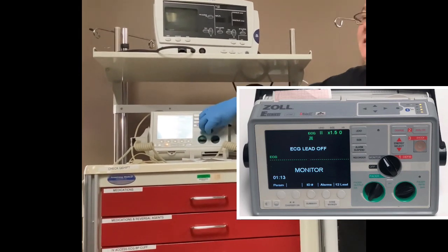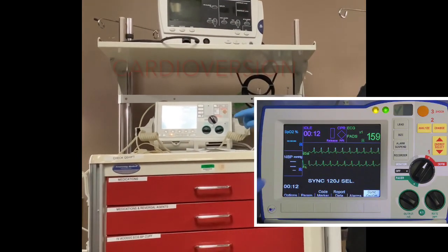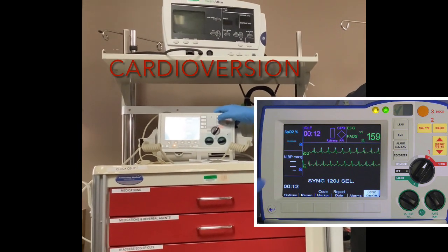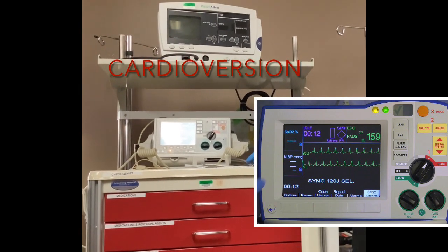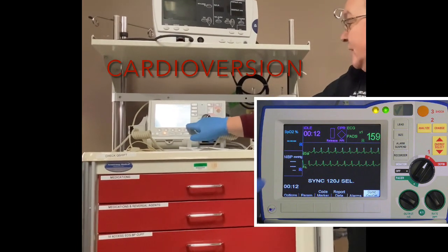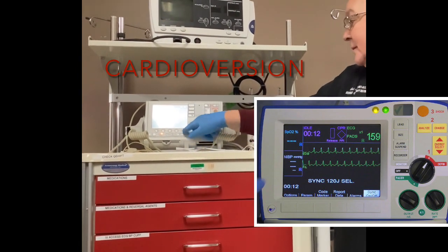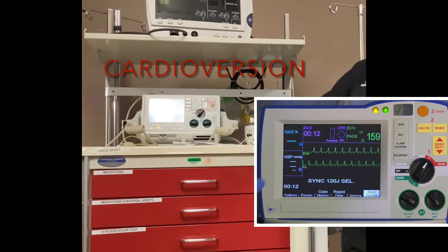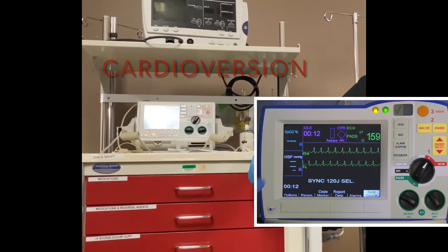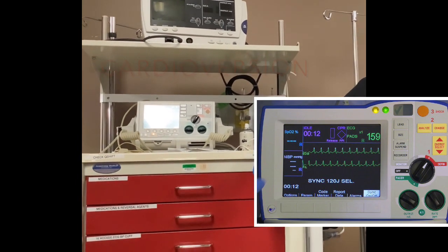Then you would wait to see what was on here. Did they come out of it? Are they still in it? And then continue compressions. Now the difference is cardioversion. You're still going to go over here to defib, but we use a smaller amount because the patient's not in cardiac arrest right now. We're trying to get that abnormal heartbeat stopped and corrected. The big difference is you have to sync because it's going to sync to the patient's rhythm. So you hit the sync button and defib changes to sync. We're syncing and cardioverting a patient with a heart rate that's unstable because they have a low blood pressure or whatever, and we need to get them out of it.